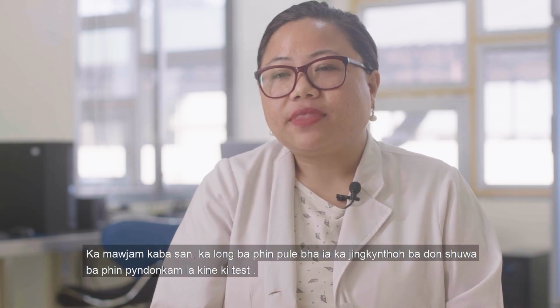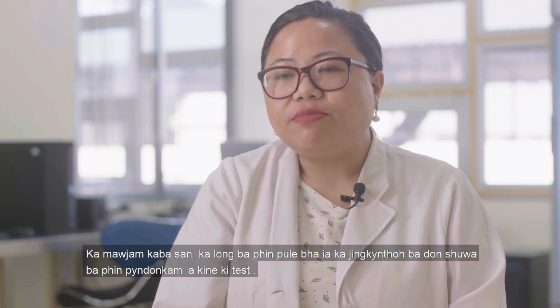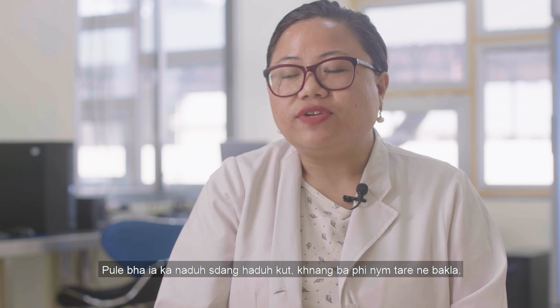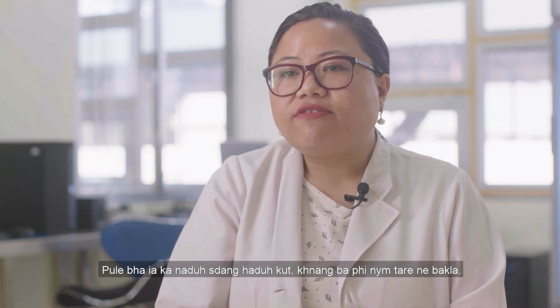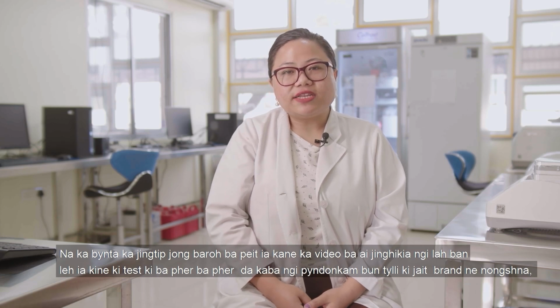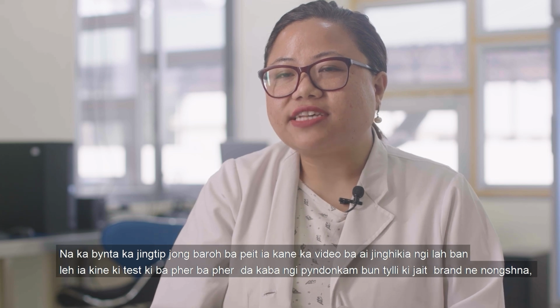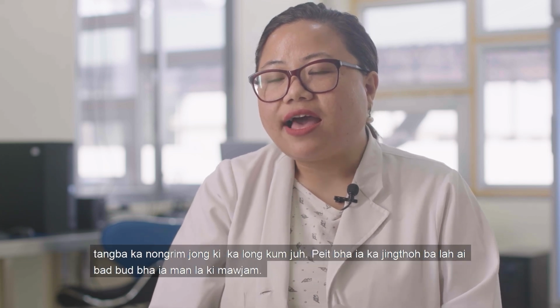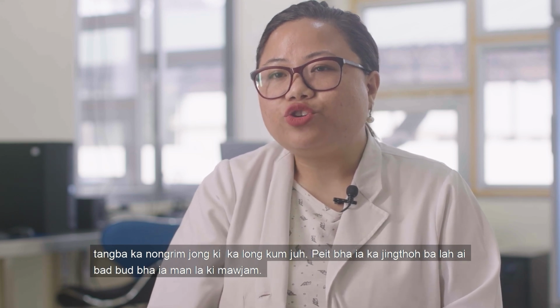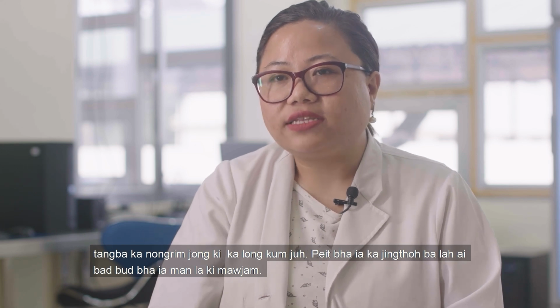The fifth step, please make sure you go through the manufacturer's insert manual before performing any tests. Read it carefully from introduction to result interpretation so that you do not fumble and you do not make any kind of mistakes. For the information of everyone viewing this tutorial, different types of tests can be conducted using different brands or manufacturers, albeit the principle is still the same. Please go through your manufacturer insert thoroughly and carefully and follow it step by step.